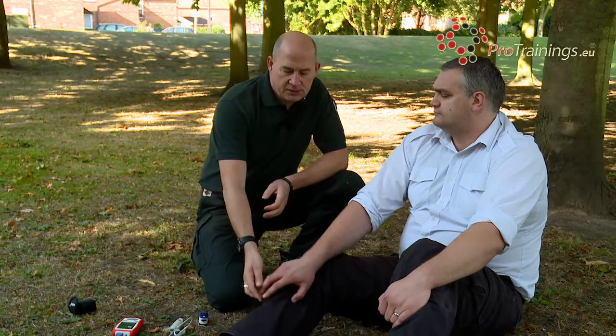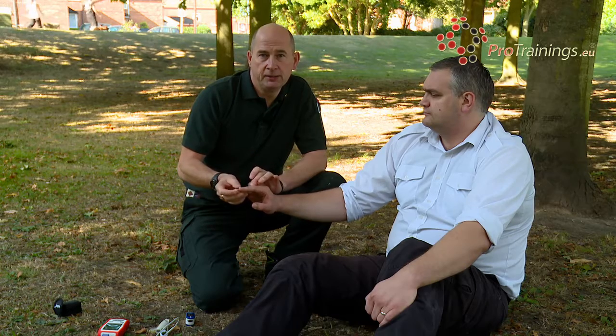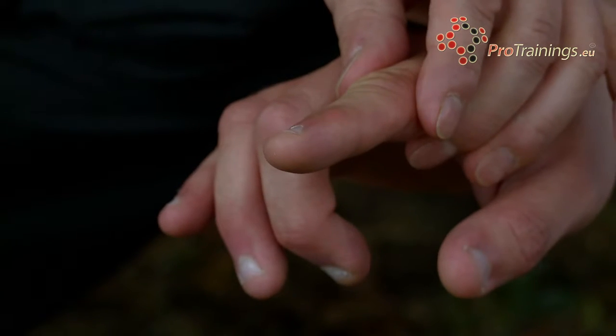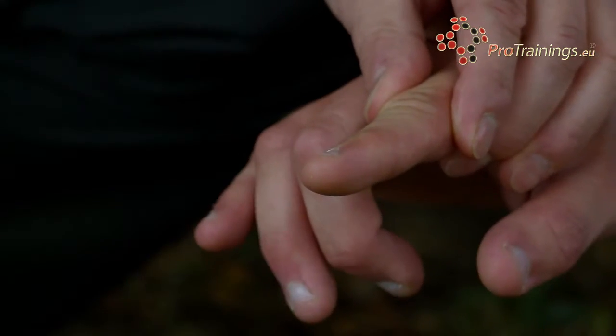First of all, it needs to go onto a finger. It can be used on an earlobe, and some can be used on nasal cavities as well these days. But the finger itself, the nail itself, needs to be clean. Nail varnish can affect the way a pulse oximeter works. If we've got a tourniquet on an arm, that will affect the way a pulse oximeter works because we're cutting off blood supply. If we have a fracture on that arm that's affecting blood to the fingertips, that will also affect the reading that you get.